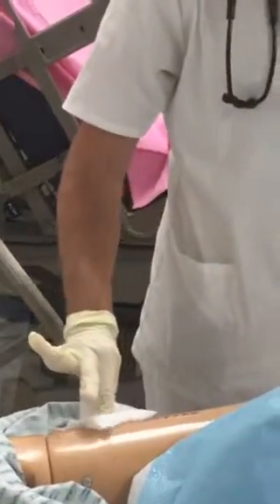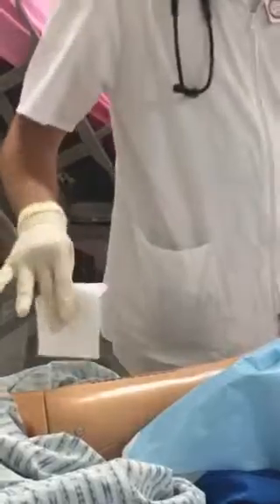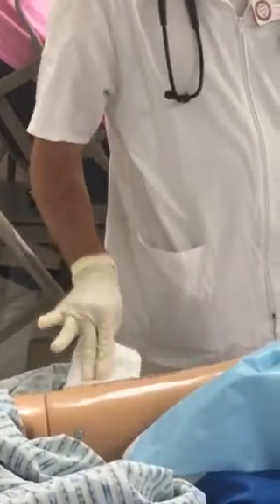So I'm going to wipe once and discard, and then I'm going to get my second one, wipe once, discard. Now I can take my dry gauze and I'm going to pat dry in the same manner from in to out and discard. Pat dry, discard.